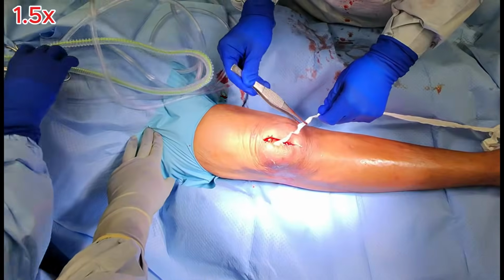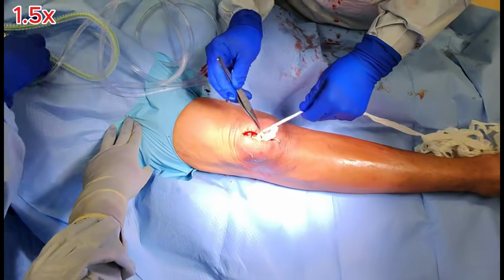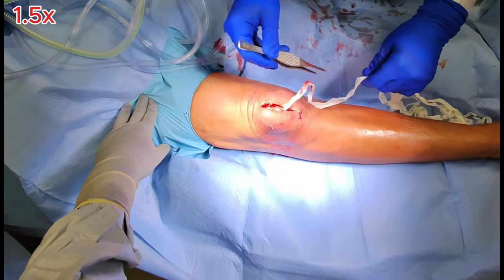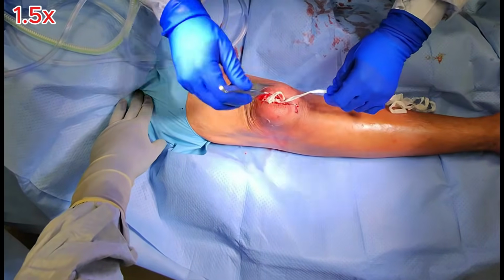Once the washing and debridement is completed, we pack the wound with gauze that is impregnated with iodoform. Iodoform is an antiseptic agent commonly used in external wounds. This gauze is easily packed into the deep sockets of the wound and helps to reduce infection risks by cleaning the wound bed.